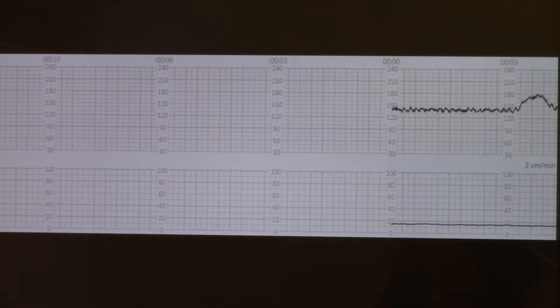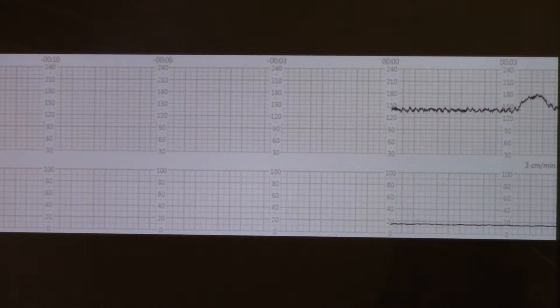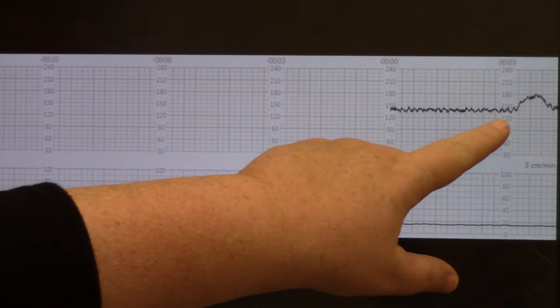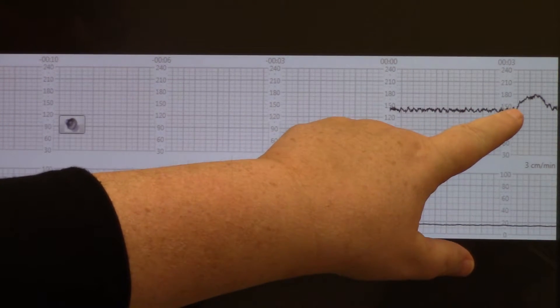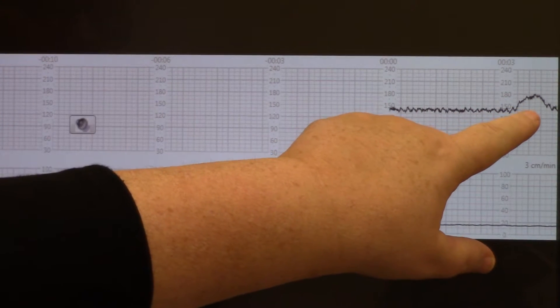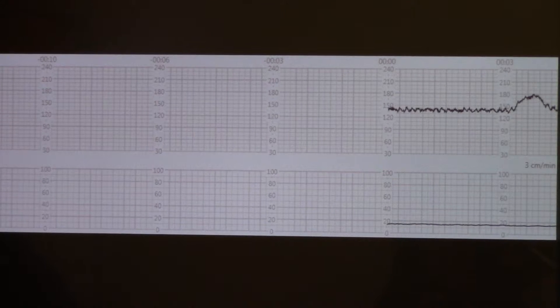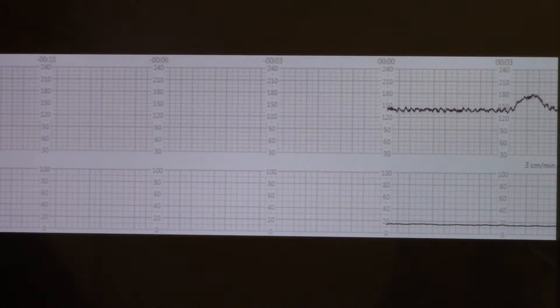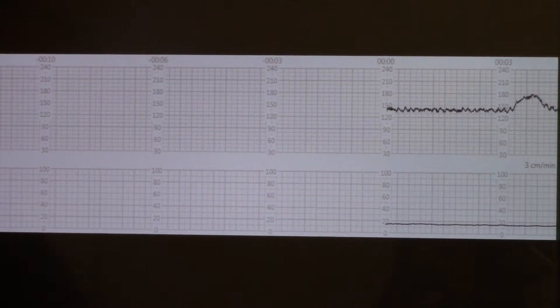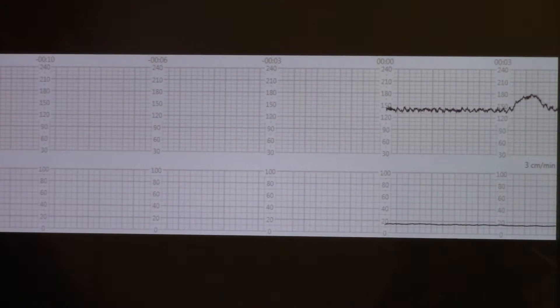This acceleration is a great acceleration as it lasted 10, 20, 30, 40, 50, 60 seconds. So that tells us there's great fetal well-being.